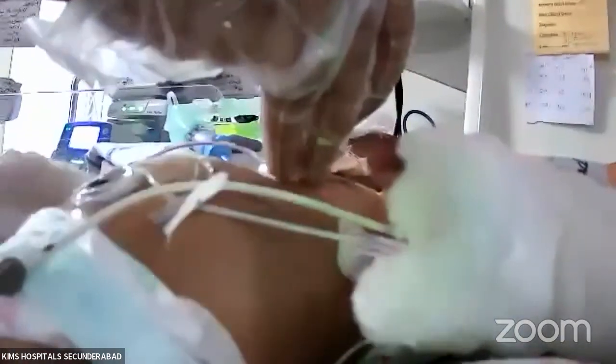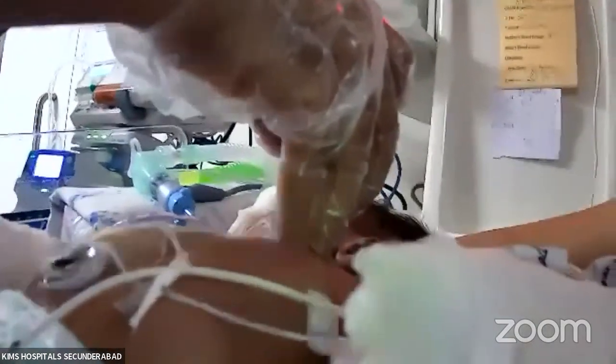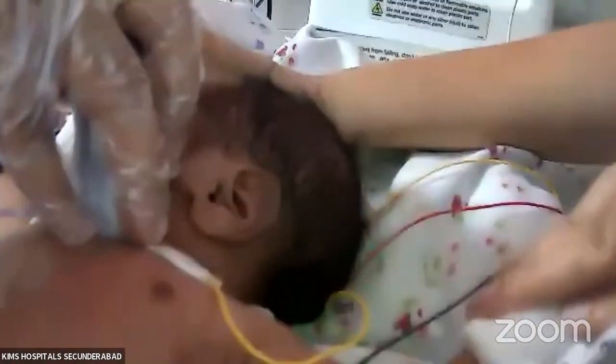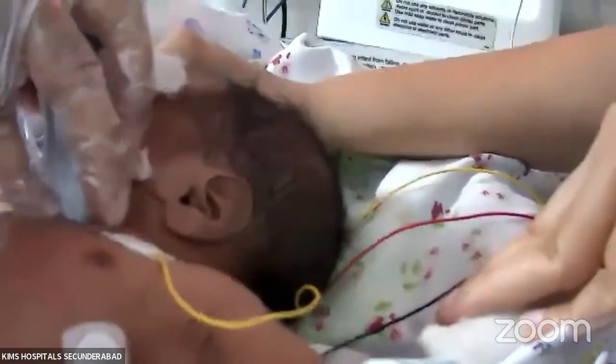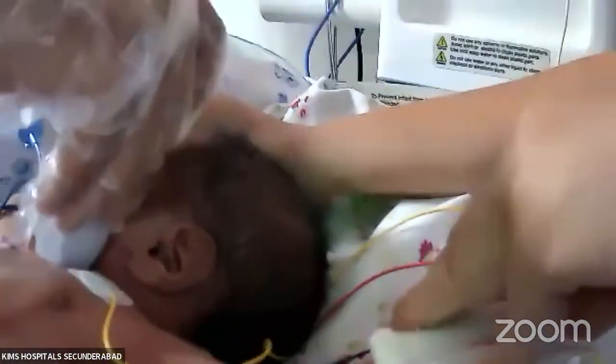In the same place, move towards the left shoulder. This is a short axis where you see the aorta in the center, RA, RV, and the pulmonary artery, which is getting divided. Okay, and then if in the same view you go up and vertical, you will see the pulmonary artery, that is known as the ductal flow, the tripod view. And if you go to the suprasternal, vertical, here you will see between 11 to 5 with the probe position, with a little tilt right and left, you will be able to see the arch.